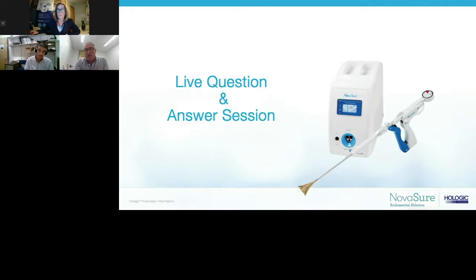But we don't routinely, for the hysteroscopy, we're doing that at the time of the fundal block anyway. So I wouldn't hysteroscope someone and then bring her back 2 weeks later for NovaSure. I would just get on and do the procedure. But there's two routes in, the one-stop HMB clinic, and then there's those that come from the general gynae clinic. But I wouldn't do an ablation on the same day as seeing them if they were a one-stop patient, because they need time to consider fertility, make sure, because it's a definitive procedure.